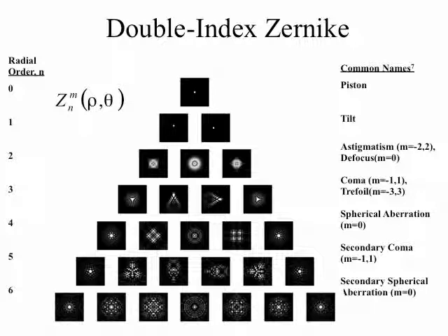You have to be very, very careful, by the way, when you look at correction of wavefront. There's a big difference between things that are described as wavefront correcting and wavefront guided. That's sort of out of the scope of this lecture, but you have to be very skeptical when you see devices or surgical treatment patterns that are described as wavefront guided. You really have to ask the manufacturer exactly what that means, because wavefront guided does not necessarily mean that it's going to correct the patient's wavefront aberrations.